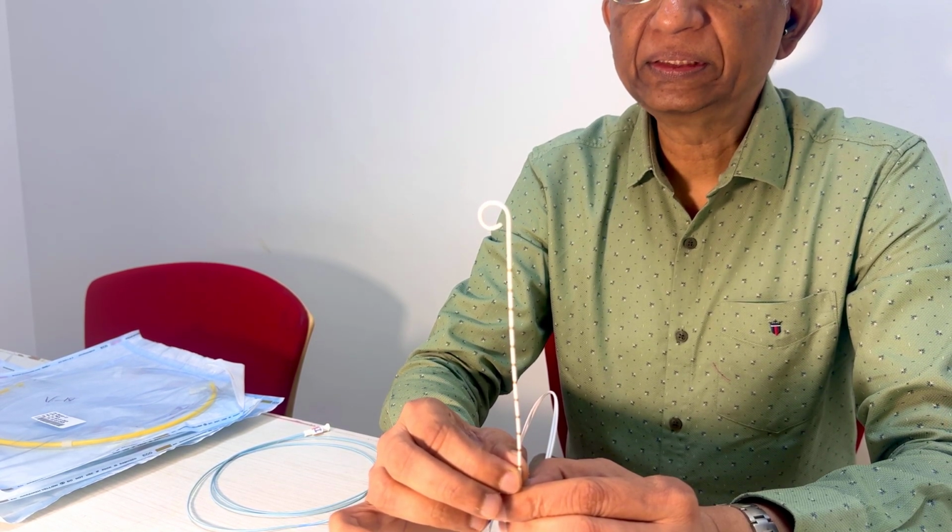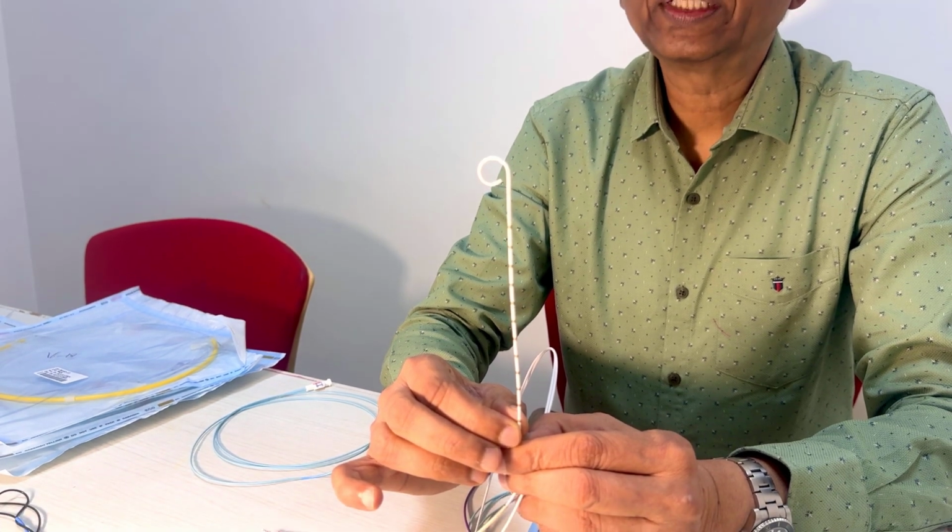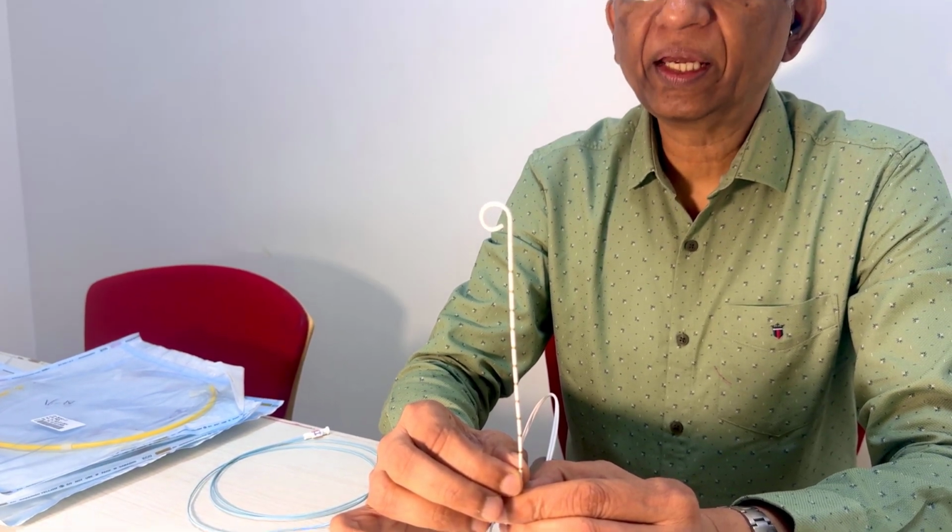Typically, you will measure this in an aneurysm. For example, you are going to treat an infrarenal aortic aneurysm. You want to know what is the exact length of the graft you like to use. We already know that on CT, but we have to reconfirm all these. So now with this pigtail inside, you can easily measure the length from the renal artery to the aortic bifurcation or to the iliac bifurcation, because each marker is 1 centimeter apart.